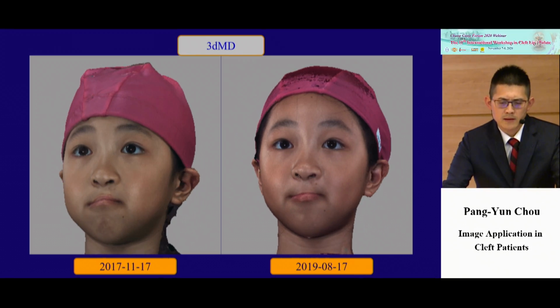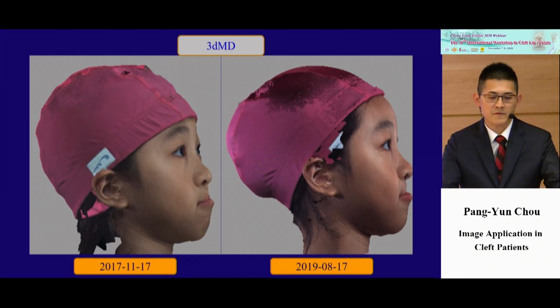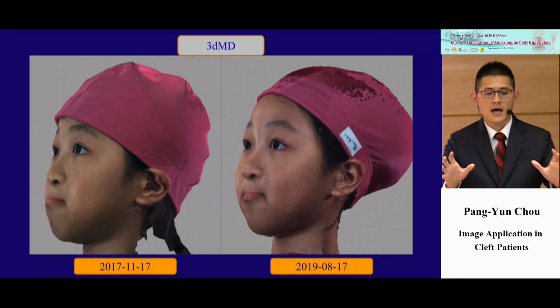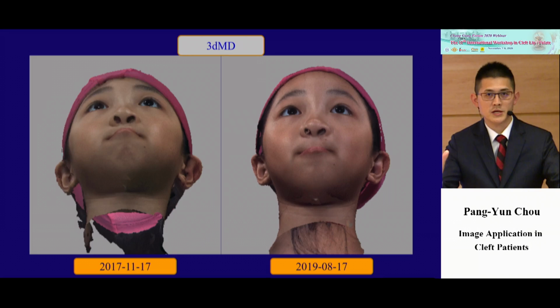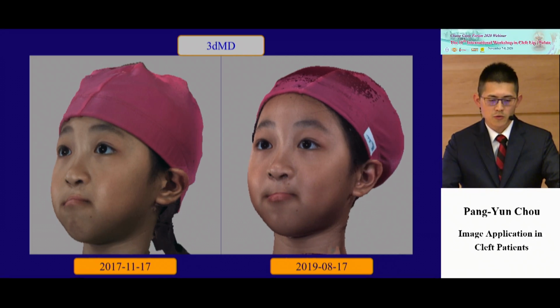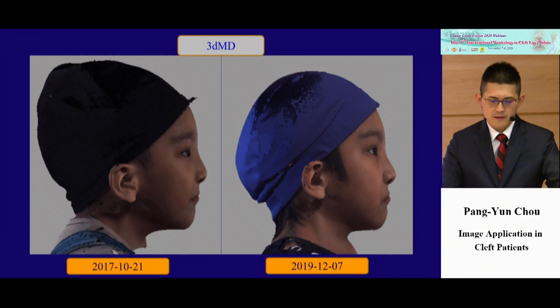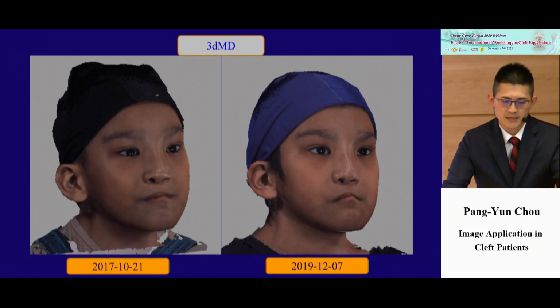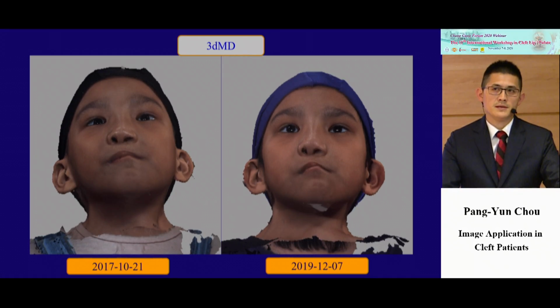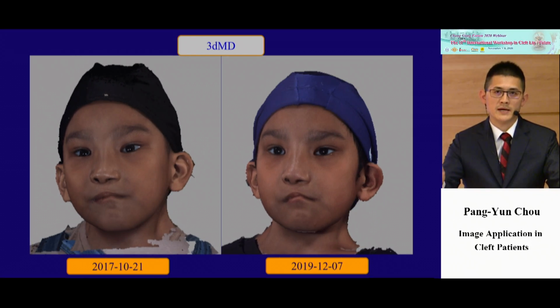And in this modality, you can not only focus on one view, you can turn around to any different view to analyze the facial ratio and the facial length, and to know whether it is bilaterally symmetric or not. Let's take another example in this 3D MD as well, pre-op and post-op. The 3D MD is very friendly, non-invasive, with no radiation dose.